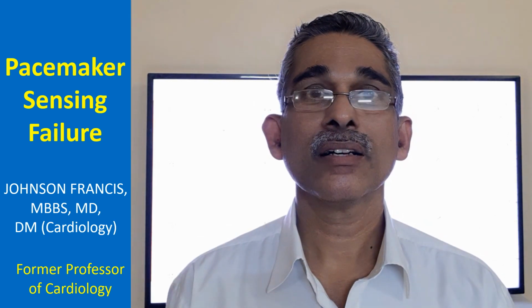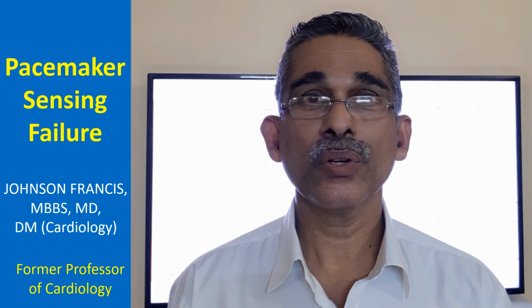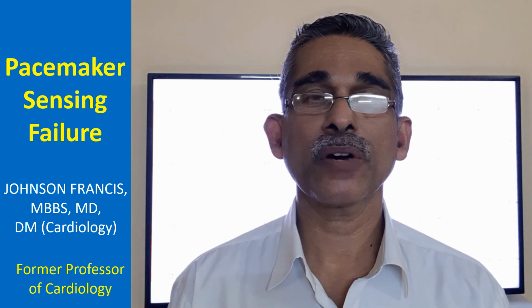Beyond that, there are special algorithms of pacing which can also be assessed, provided you know the programmed parameters of the pacemaker. Some parameters may be different in different pacemakers. So what you think is abnormal for one pacemaker function may be normal for another pacing algorithm.